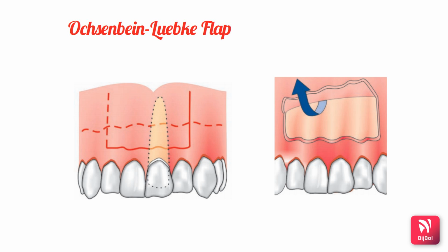The crestal bone is also not exposed and there is adequate surgical access, which also gives good wound healing potential when compared to the semilunar flap. But this flap also has some disadvantages, such as disruption of blood supply to the unflapped tissues, and there may be flap shrinkage, and sometimes it is difficult to reapproximate and close the wound with this flap.